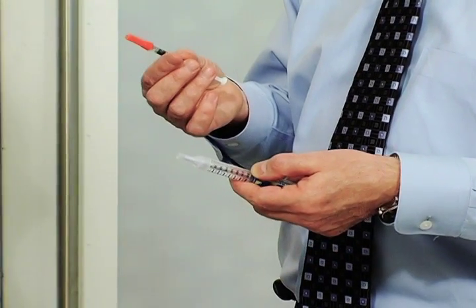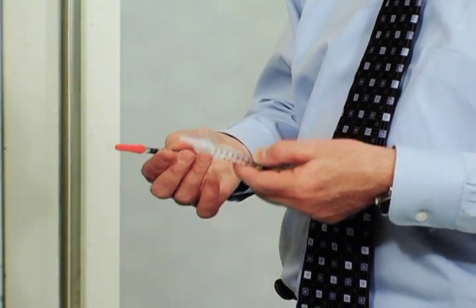I want to begin by allaying any apprehension you may have. I think you're going to find this to be a painless procedure, but you'll tell me afterwards. There are two devices that we utilize to inject insulin: one is an insulin pen, the other is a traditional insulin syringe. Both can be utilized for virtually any kind of insulin.